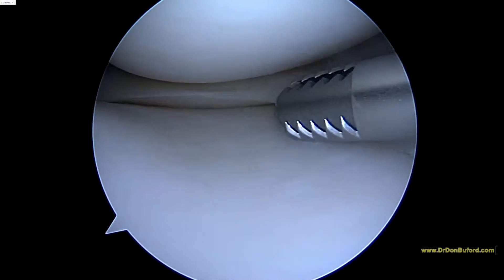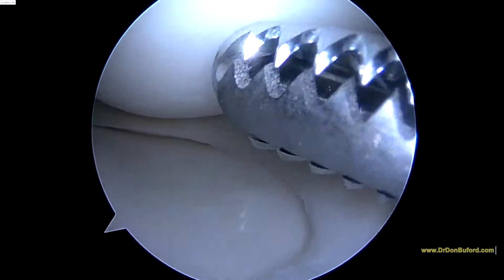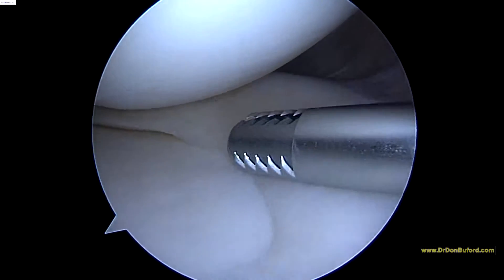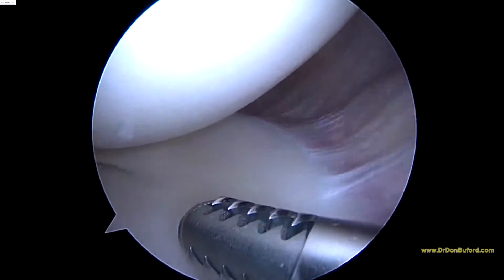This is the medial compartment, and this actually looks really good. I don't see any significant problems here. The femoral condyle looks good. Meniscus looks like it's in good shape. And here's the tibial plateau, and the articular cartilage here looks like it's in pristine condition. So I'm very happy with the way that looks.